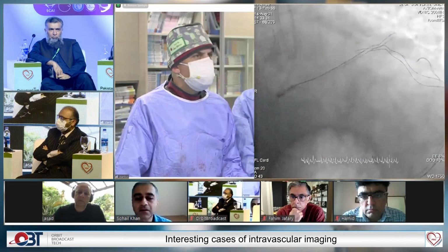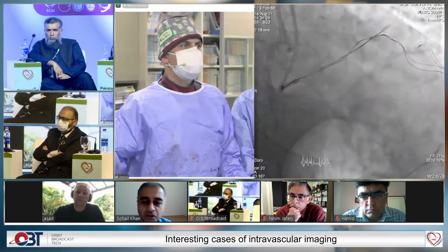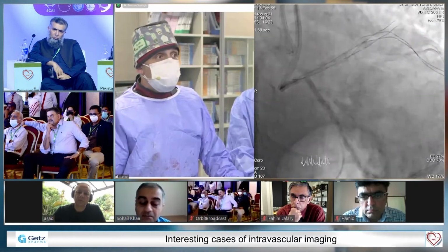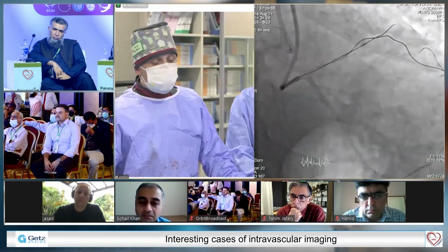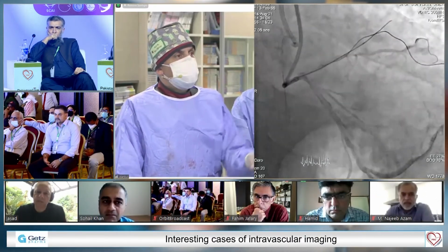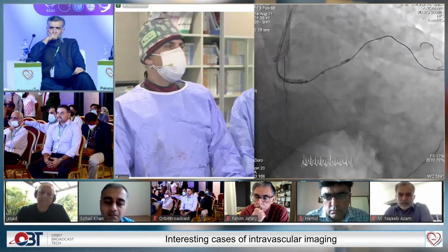concave, right? Concave, yes. Omar, can I ask, is your retrograde wire subintimal, or is it in the true lumen? I'm not sure. Now I will tell us, but I like to trust more retrograde wire than antegrade wire, because antegrade wire is totally blind, and retrogradely it's easier to stay intraplaque, I believe. How about guidewire-based re-entry? Yeah, we did IVUS because I like to make sure 100% where I am, and IVUS shows me.